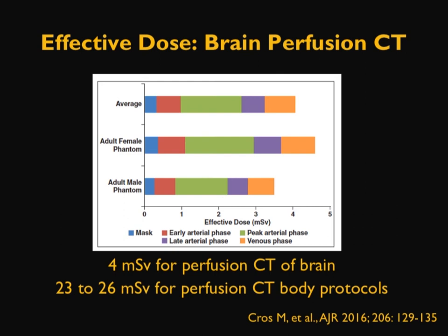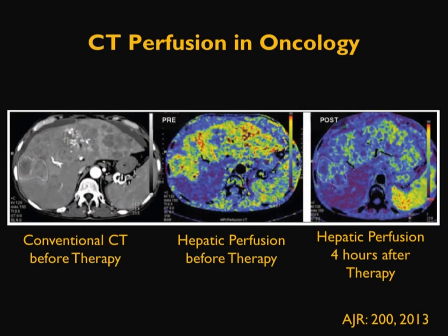So as physicists, we evaluate or monitor these doses, such as the peak skin dose, for watching out for any type of deterministic effect.